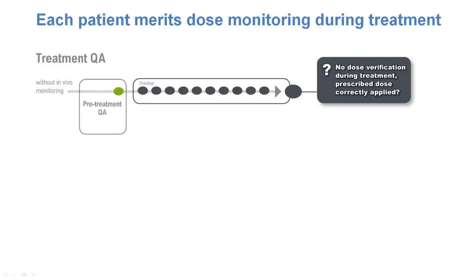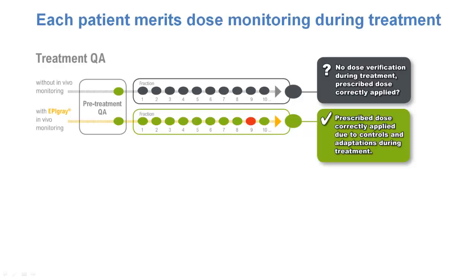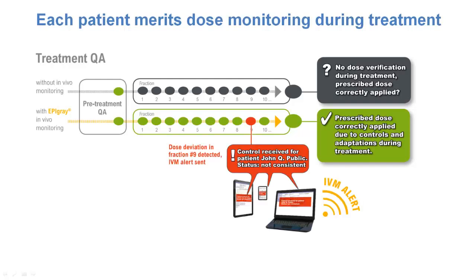Of course, treatment QA can be performed prior to the treatment, so you can verify the plan before the first fraction. But how can you guarantee that during the treatment, the prescribed dose has been correctly applied? The EpiGray solution can help you with that.